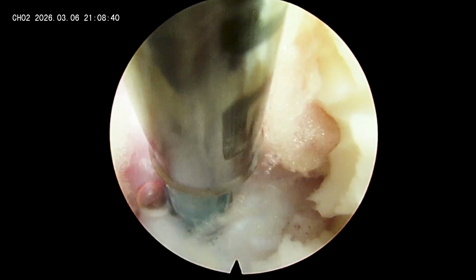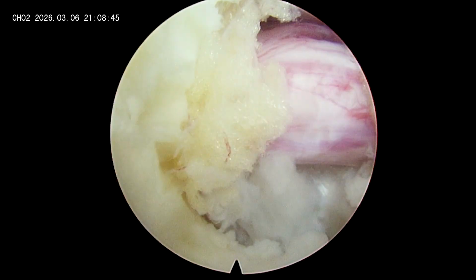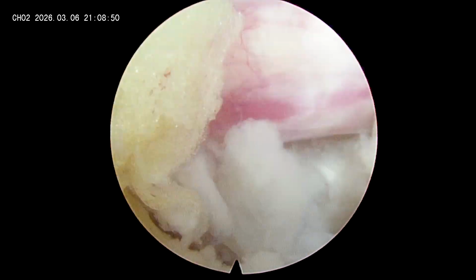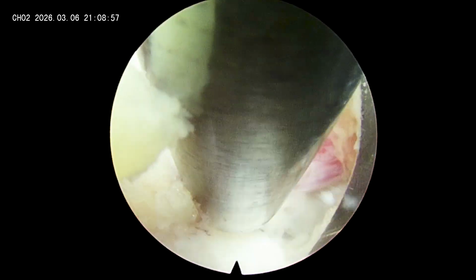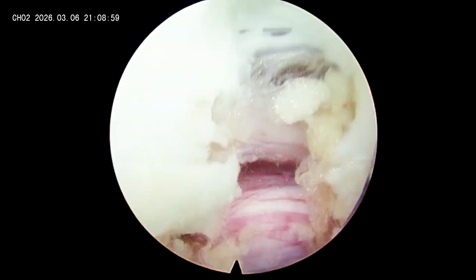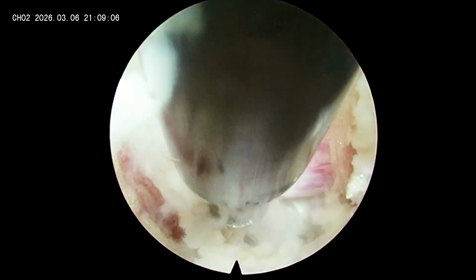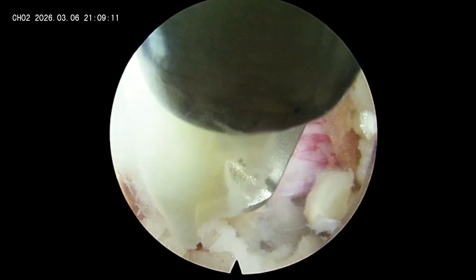In a young patient, the disc is very hydrated, so if you use a radiofrequency ablator, you can easily shrink those disc fragments. Here I'm just creating a little bit more space caudally.